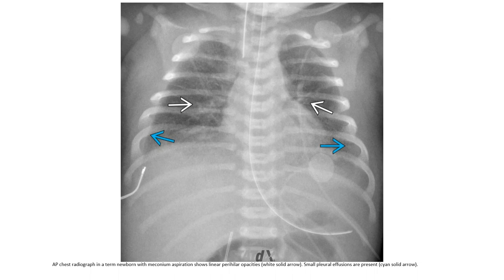A radiograph in a term newborn with meconium aspiration shows linear perihilar opacity, small pleural effusion indicated by the solid cyan arrow.